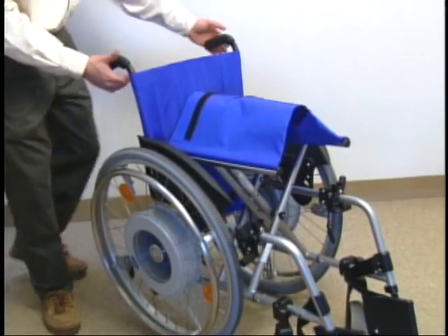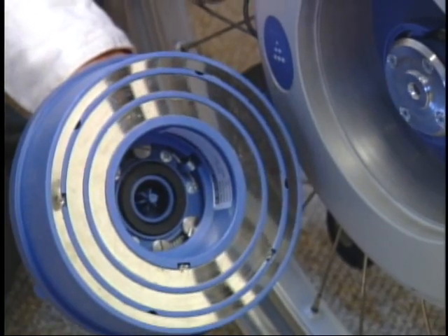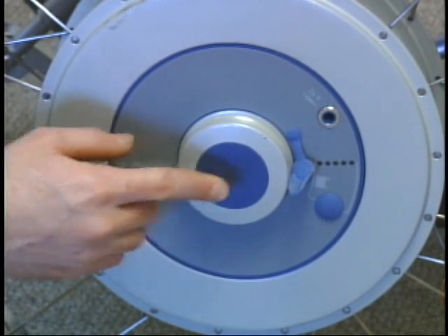Wheelchairs remain foldable with an Emotion installed, and it can also be installed on most rigid wheelchair frames. Emotion batteries may be inserted in any position. Pressing and holding the blue button turns the system on.